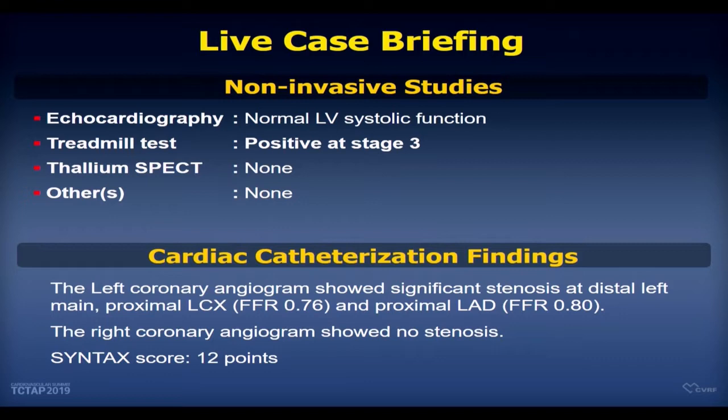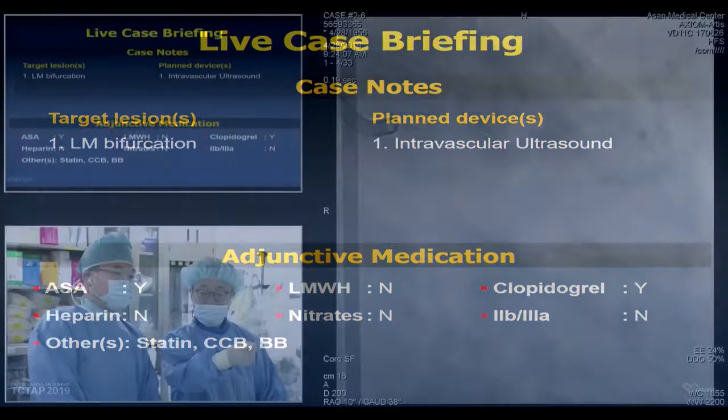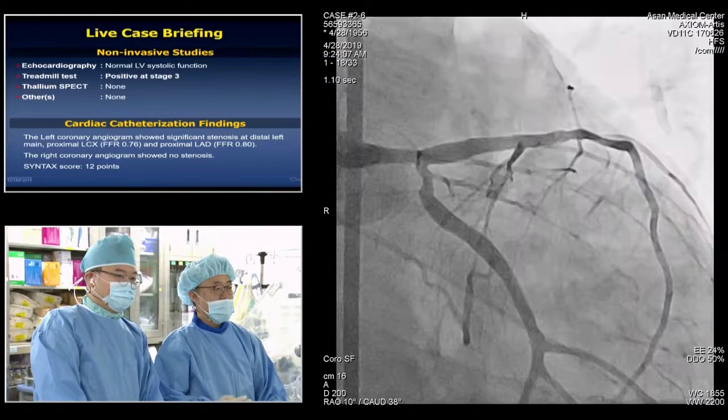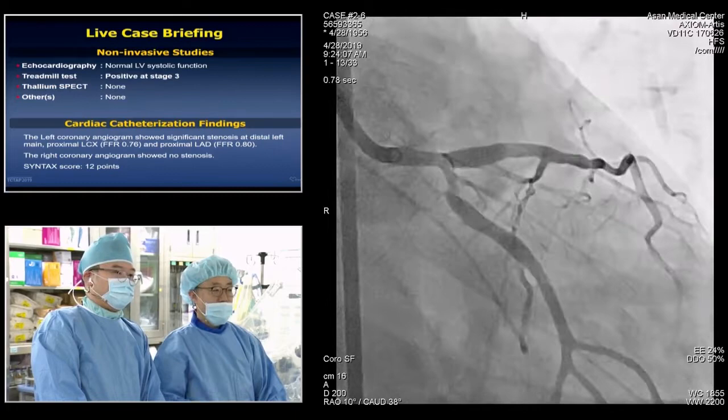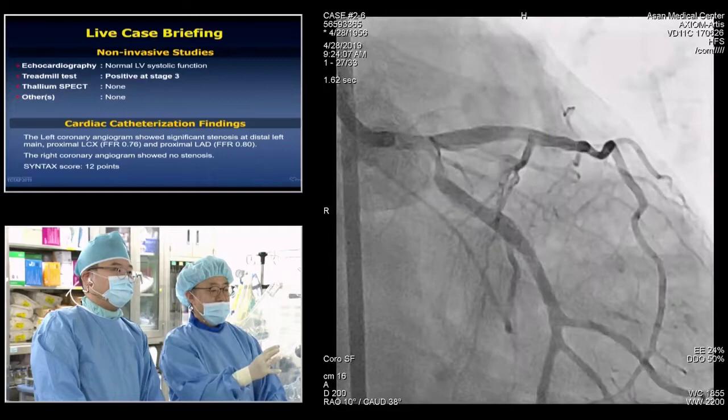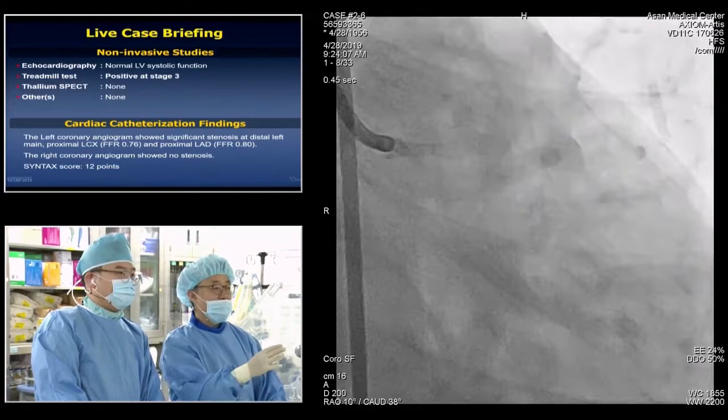Could you show us the previous slide? I think this patient is a typical patient, a relatively young 63-year-old male, presented with stable angina. Treadmill test is definitely positive at stage 3, and he has hypertension. Looking at the angiographic view, you can see the disease was confined to the distal main. The right coronary was normal. The overall SYNTAX score of 12 is in the low group.